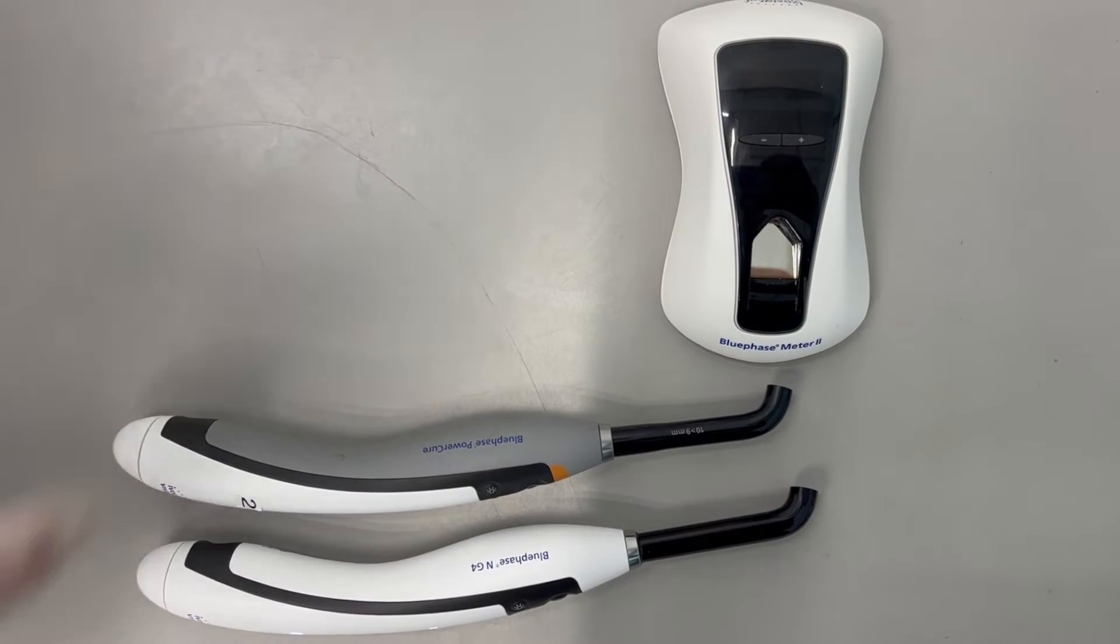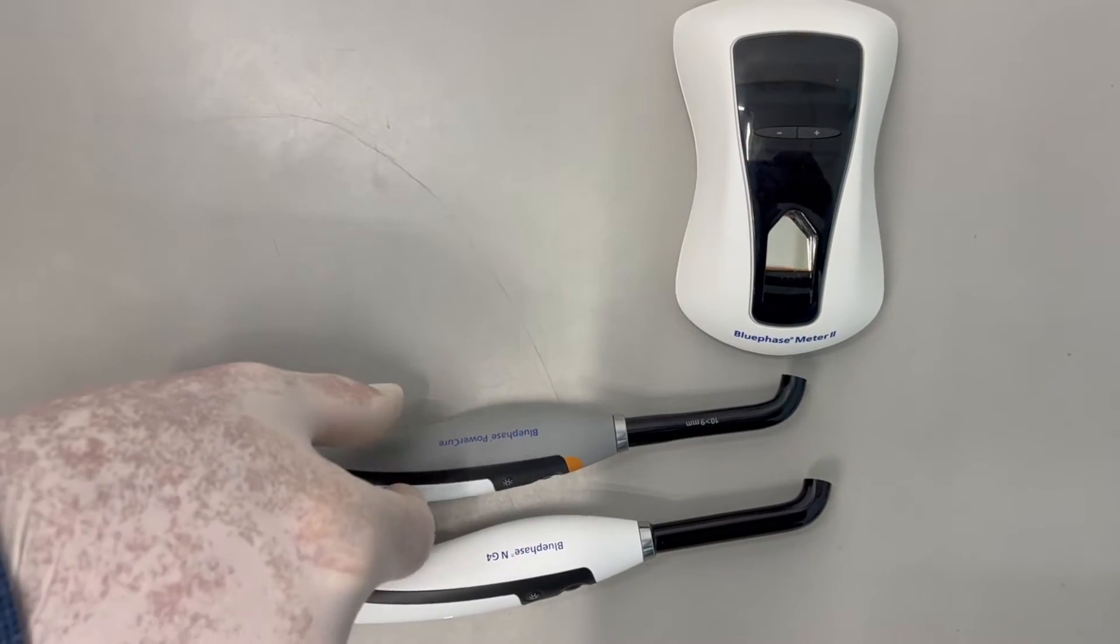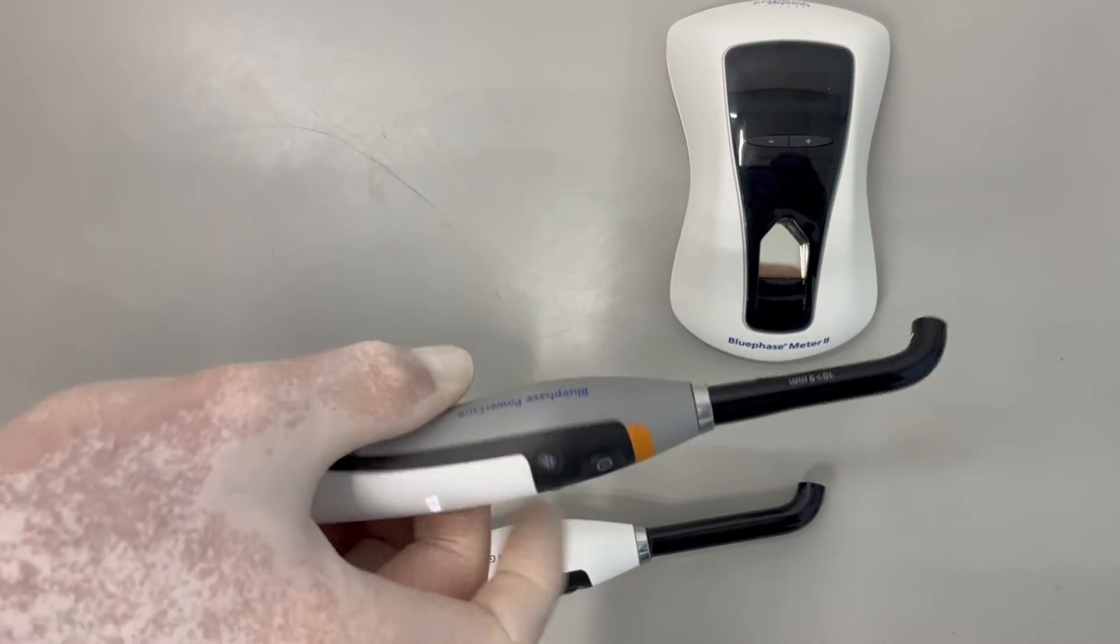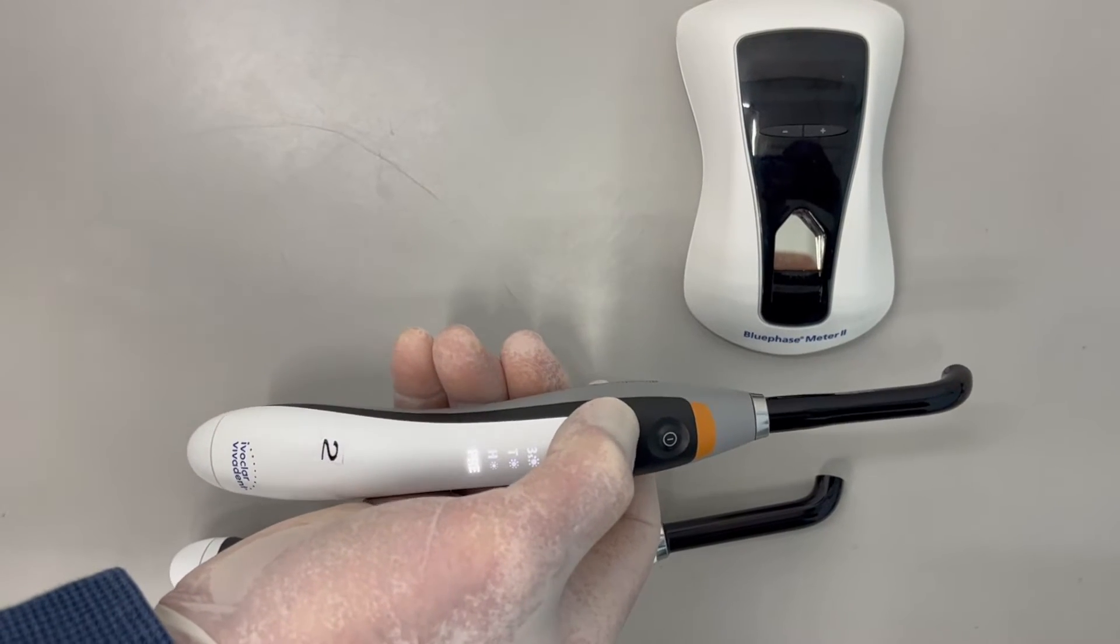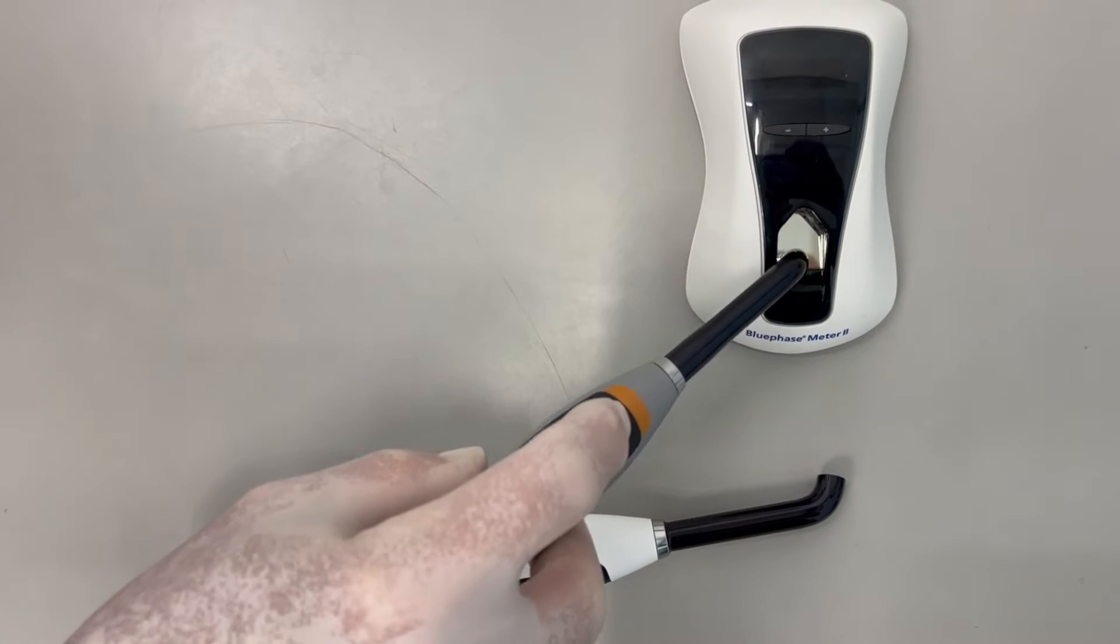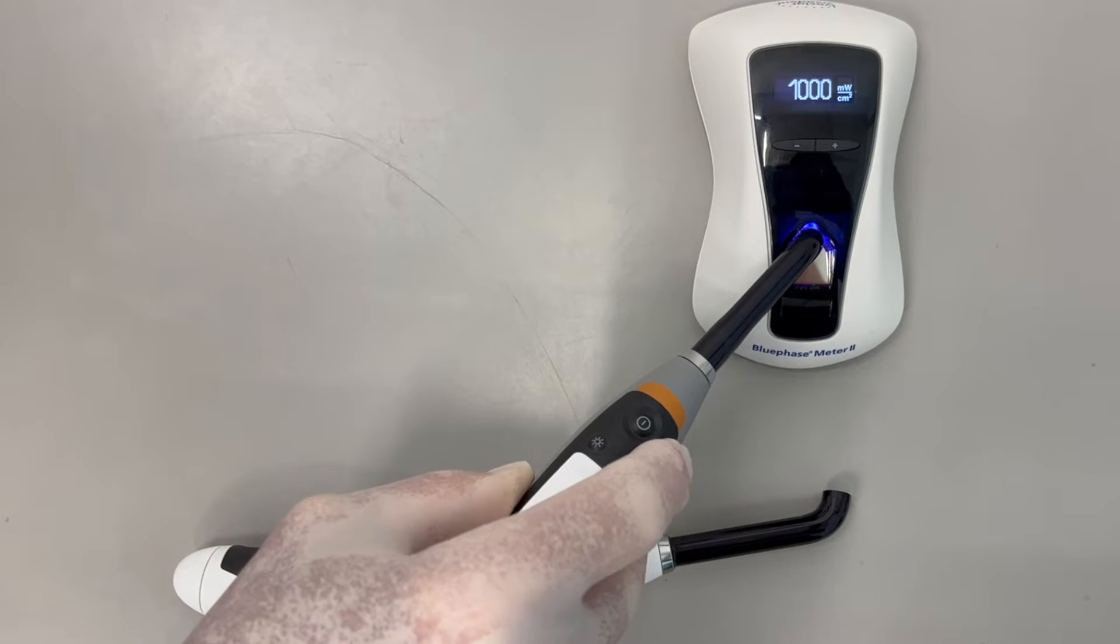Here we see the lights being used on the Blufase Meter 2. First, we set the tip diameter to 9mm and the light to the high power setting. The irradiance is 1000 milliwatts per centimeter squared.